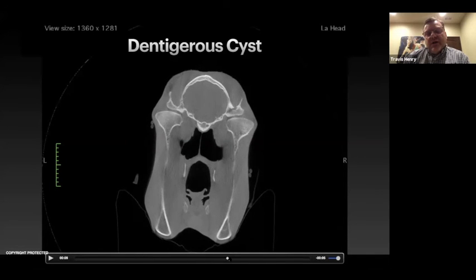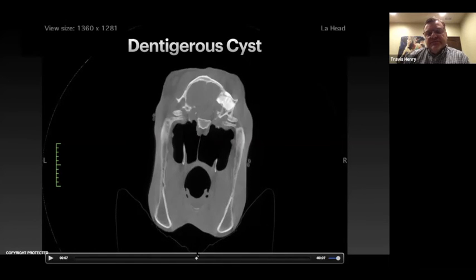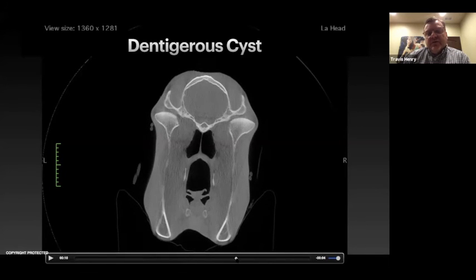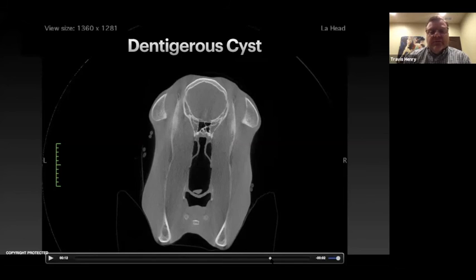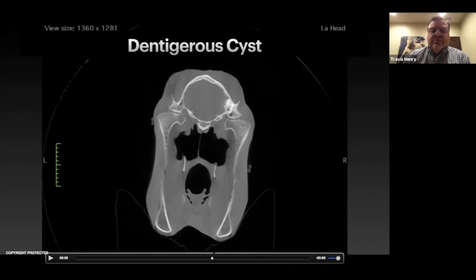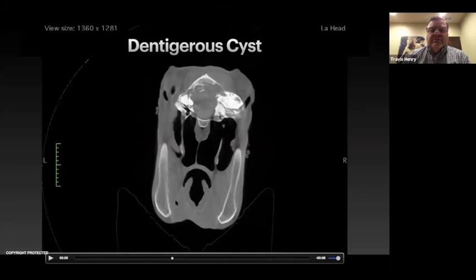We opted to not do surgery on this horse as well. The client consulted several other neurologists and surgeons around the country, and they all said that it wouldn't have been a good prognosis. About 3 weeks after the CT, the horse started having horrible neurologic signs and went down and ended up being euthanized. But this is just showing you how important CT is in these cases, because it really can guide you as to what you're getting into, especially in this region right here.